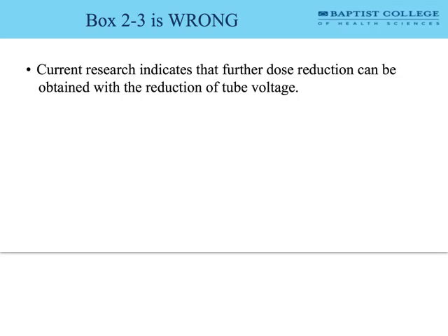Why not? Well, the current research indicates that further dose reduction can be achieved by just reducing the tube voltage. And that has to do with these software packages that we can tie it into. We can reduce the voltage, we can reduce KVP, and use the software to get rid of the noise. That's the short answer. We'll talk more about it when we talk about reconstruction. Okay? But this is, again, controversial. I will not be testing you on box 2.3. Just know that it is a controversial area. It is not as simple as it's presented there.